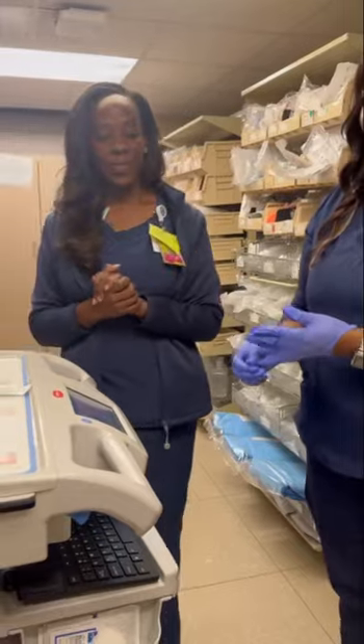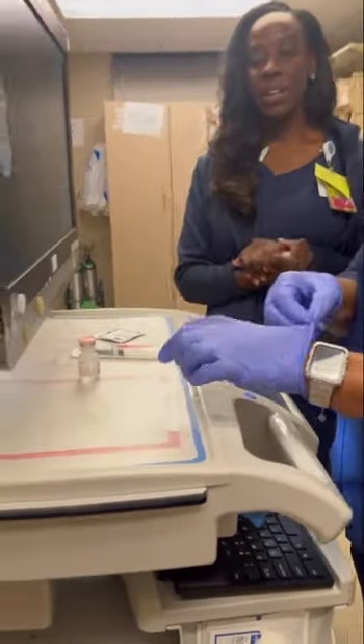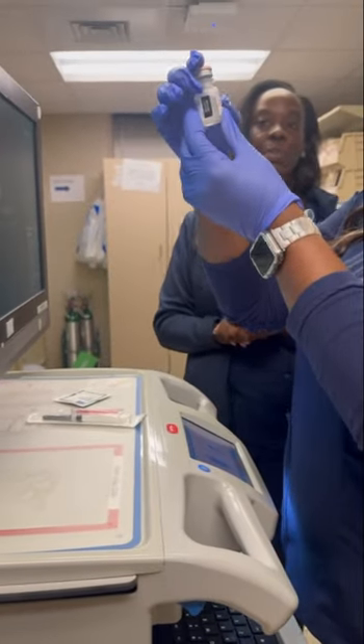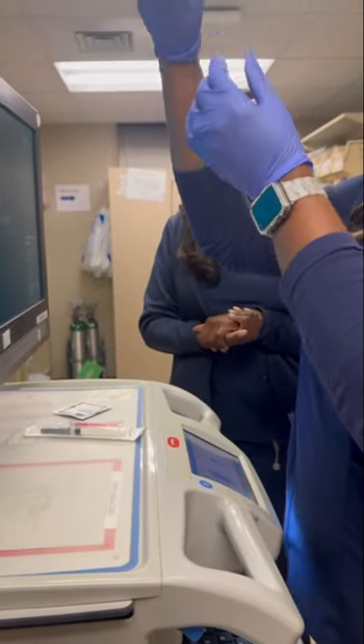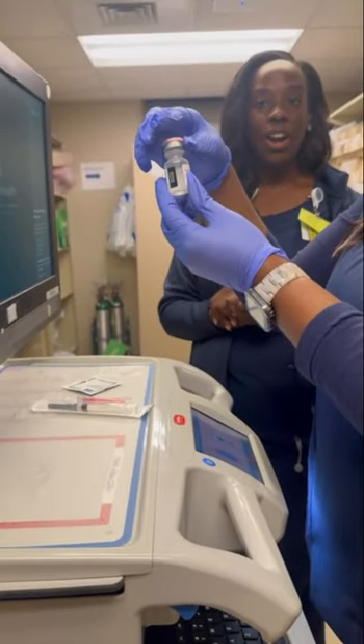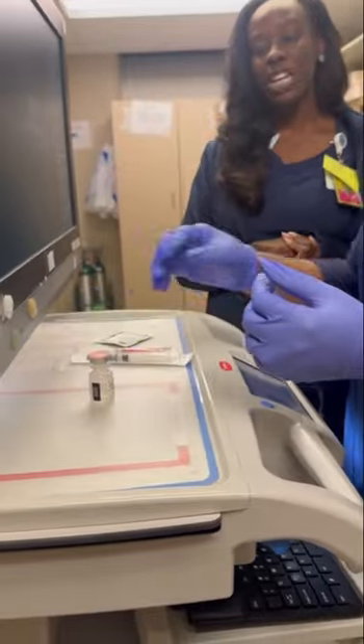First, we would inspect our vial to make sure that the date is correct, that there aren't any broken particles or any floating pieces in there. If you see anything out of the normal, do not use it — discard it or return it to your pharmacy if you are in a hospital setting.